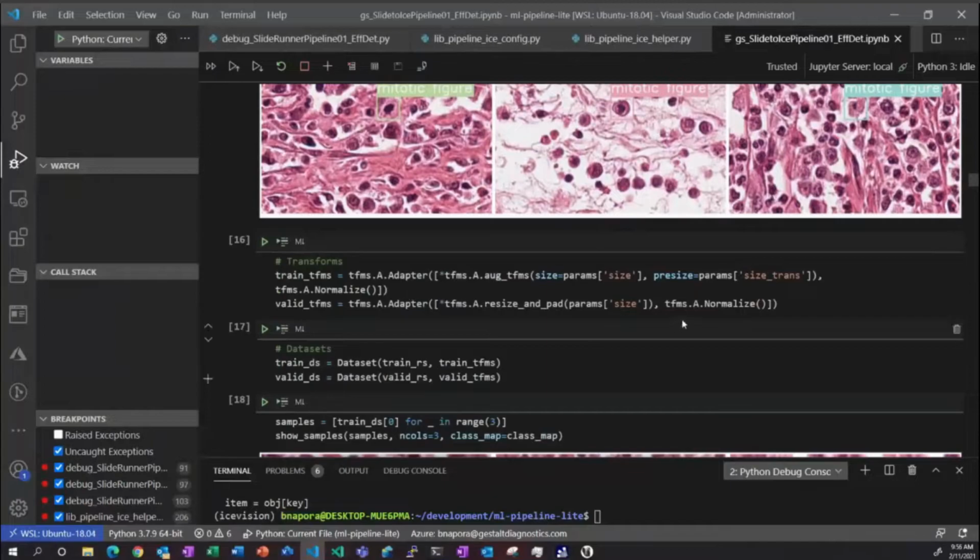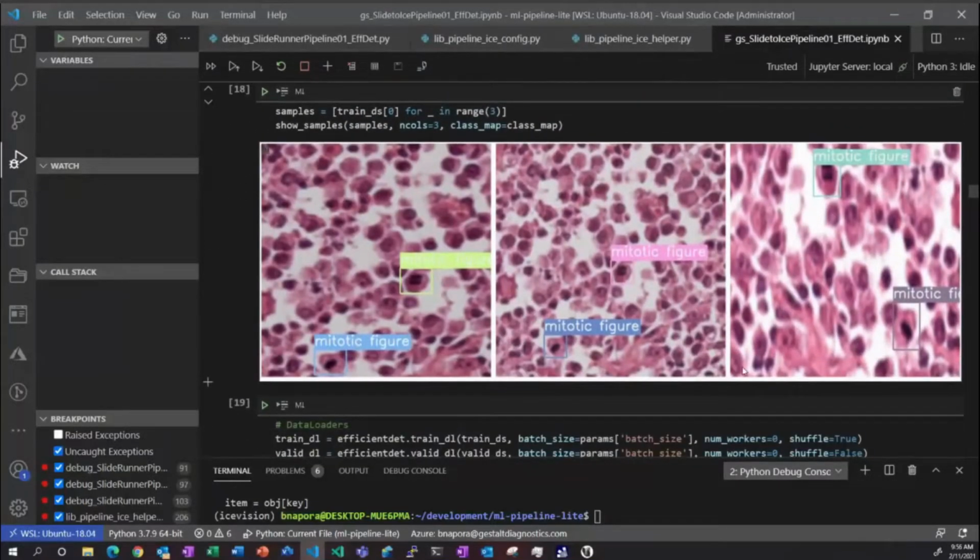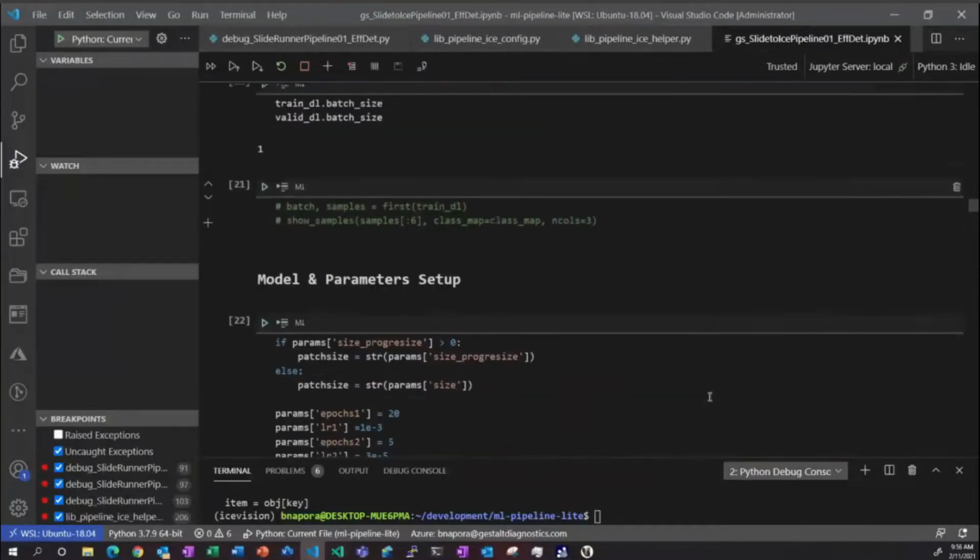Using just the standard transforms, I haven't, at least in the IceVision pipeline, done a ton with the augmentations library yet, but doing a little bit of resizing and shifting of the images to get some variation, and you can see the impact of those transforms on the individual patches.